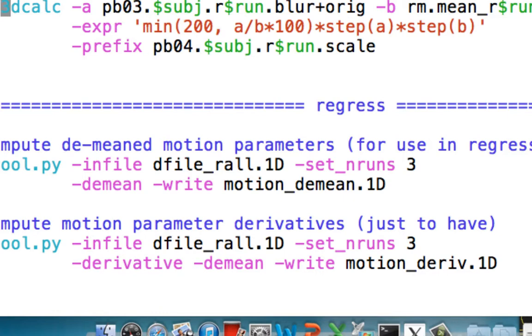So first of all, it calls upon 3dTstat, which the default is just to calculate the mean. So it calculates the mean of all these blurred data sets that we had a couple steps ago, and then creates this rm.mean. Anything with an rm, by the way, in these processing streams, those are things just for intermediate steps, and they're cleaned up afterwards.